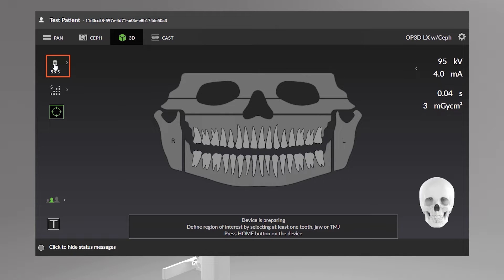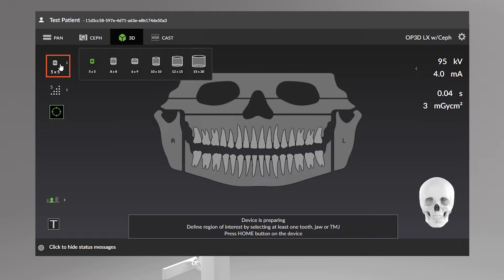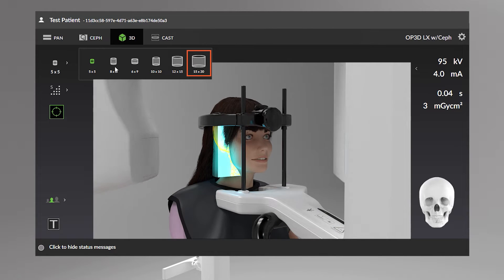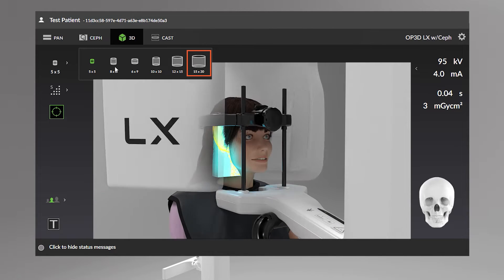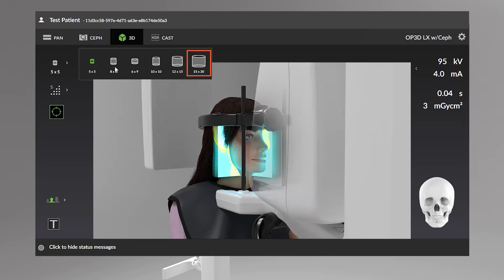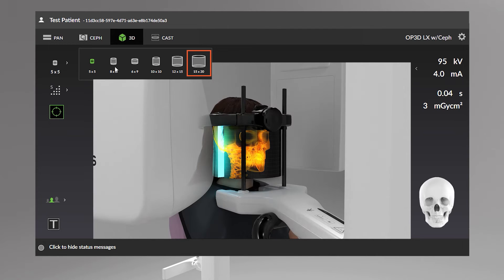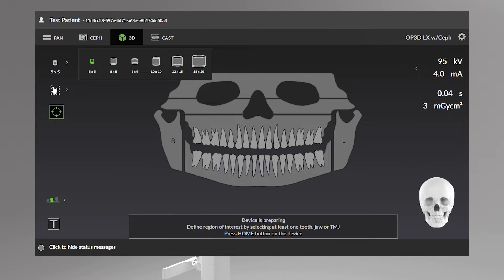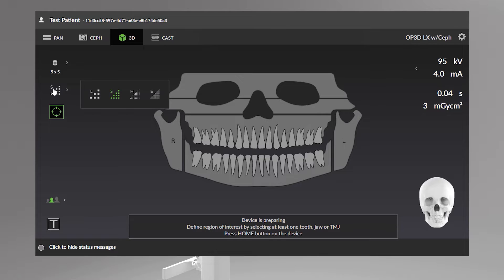Here you'll find the field of view size selections, presented as height by diameter. For example, a field of view that's 15 by 20 corresponds to a cylindrical volume with a height of 15 centimeters and a diameter of 20 centimeters. Select an image resolution.